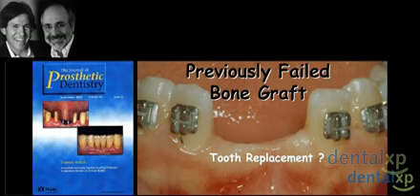Well, one of the problems that we always have when we're looking at cases is that we really have to decide on what is the best treatment plan and treatment sequence for management of this type of problem. First of all, we've seen already that the central lateral in the maxilla is a very difficult environment because of the anatomy and because of the spacing issues. Henry has once talked about it being the Bermuda Triangle of implant dentistry because of the anatomical limitations. Just simply placing an implant in the central lateral doesn't give enough space. One of the other problems we have is really in the lower incisor region, placing 2 implants next to one another because of the narrow ridge, and then of course because of the anatomical limitations distally.